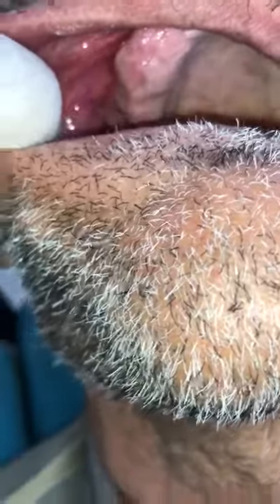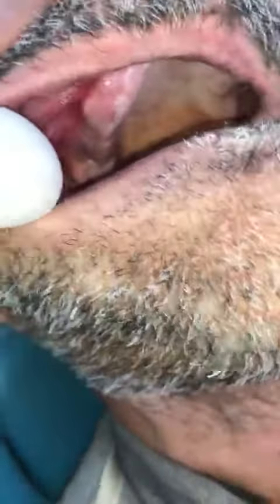If you come closer here, you can see it's a wide area with multiple fiber attachments. This is what's different between the buccal and the labial: the labial is usually a single thin line in the middle because it's fibrous, but this one is a buccal — a muscular attachment that comes from the modiolus.